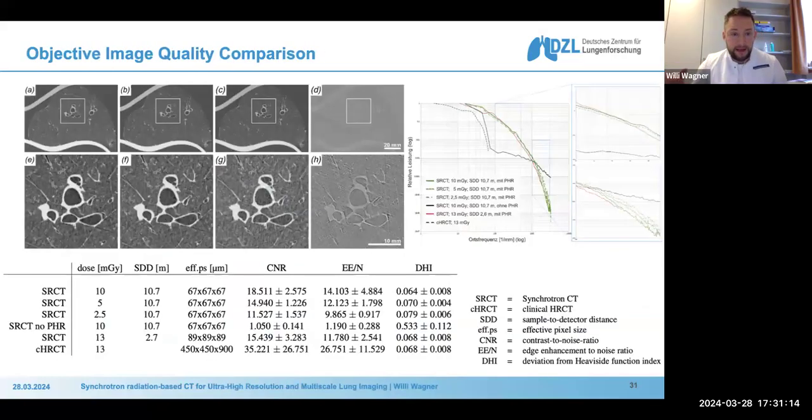Sure. Let me go back to this slide to address your question. Of course, radiation dose is the number one safety issue that we have to talk about when it comes to imaging patients in a synchrotron facility, because it's potentially lethal what you can generate with a synchrotron. What we have done to measure radiation dose was first ionization chamber measurements, and then later we went ahead and implanted TLDs into the specimens.